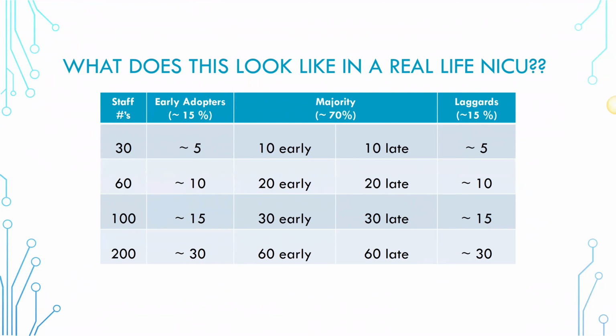So knowing that you have a protocol in place of when to monitor and for how long, maybe you want to monitor 24 hours after you finish rewarming, and your EEG department wants to pull the device right at rewarming. So you have to have a decision. So then we need to switch over to our unit-based device. Or maybe we want to continue until the baby goes to MRI. So those are just all decisions that you can make in your unit.